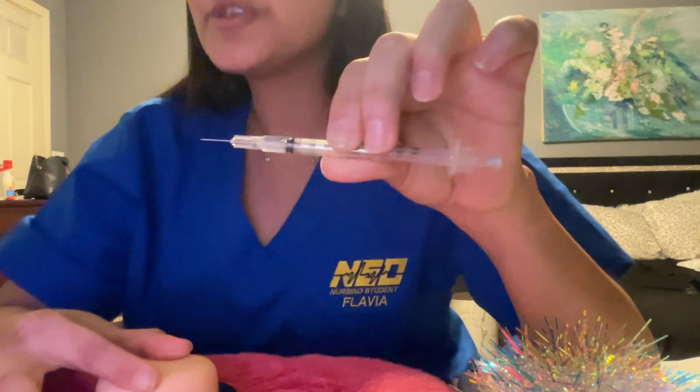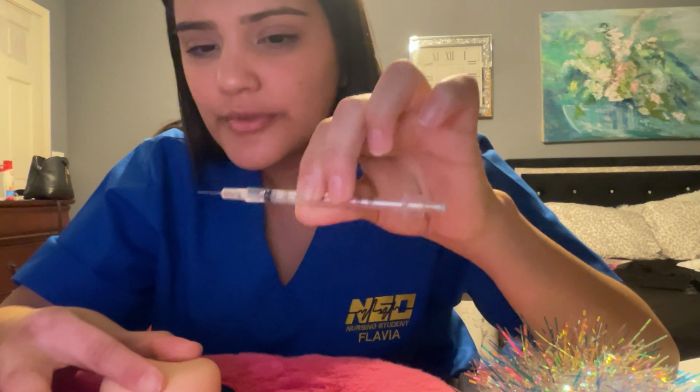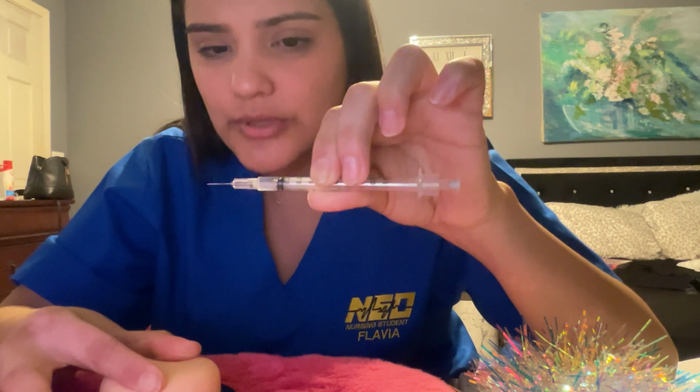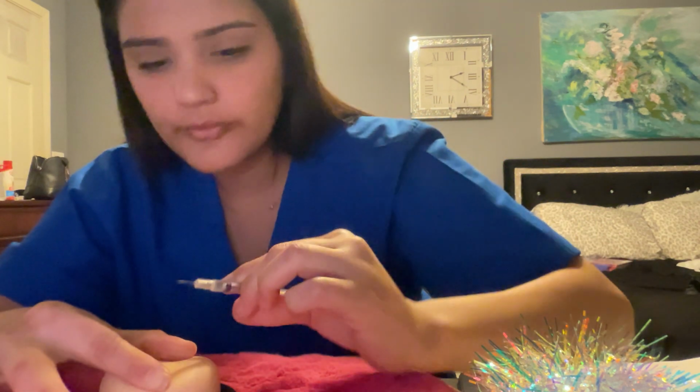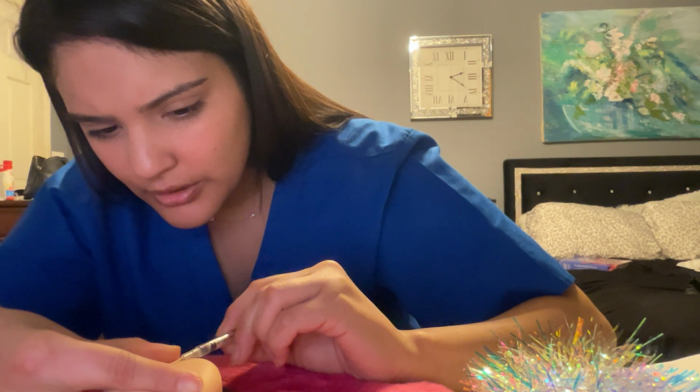And since it's intradermal, you want to go at a 5 to 15 degree angle. I don't know if you can see that. Get right under the skin, just like that.